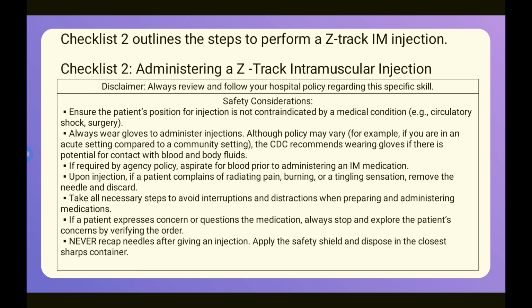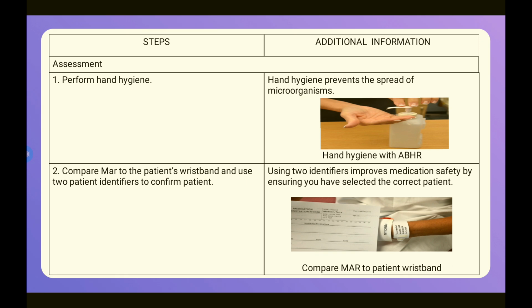Take all necessary steps to avoid interruption and distractions when preparing and administering the medication. If a patient expresses concern or questions the medication, always stop and explore the patient's concerns by verifying the order and answer the patient. Never recap the needles after giving an injection. Apply the safety shield and dispose of it in the closest sharps container. And then we will speak about the procedure.